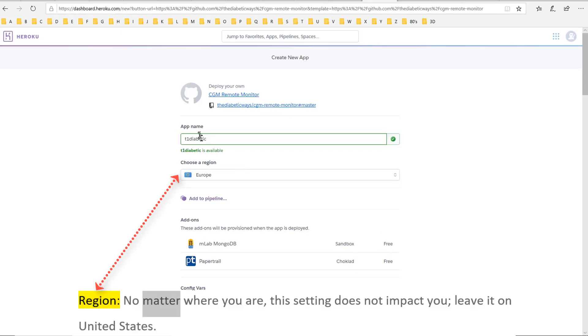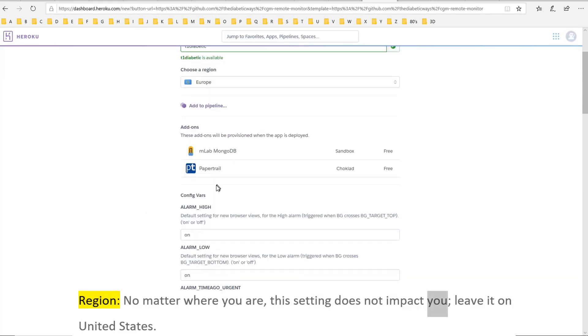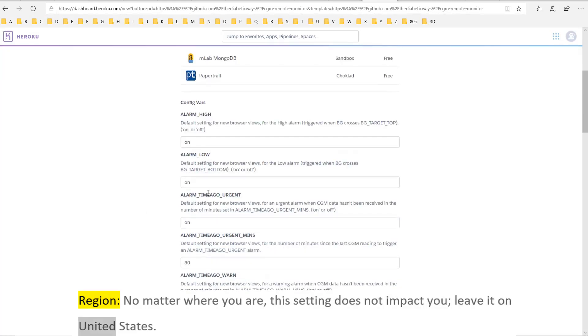Region: no matter where you are, this setting does not impact you. Leave it on United States.